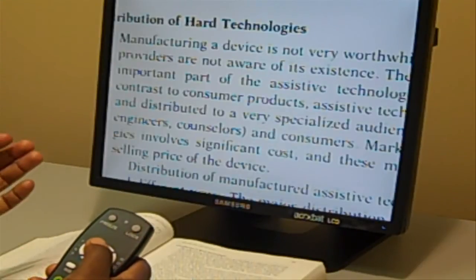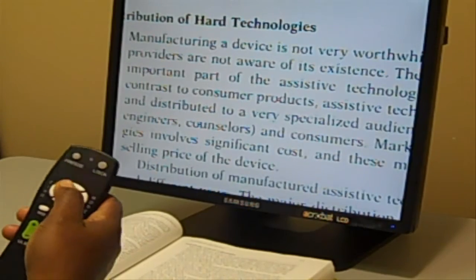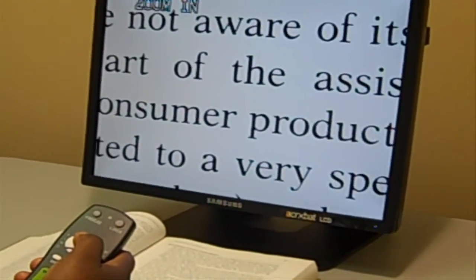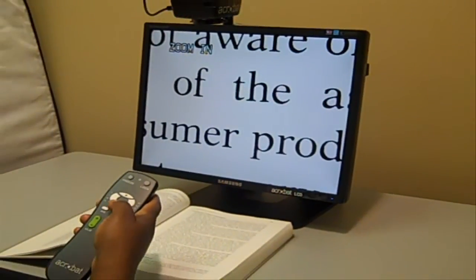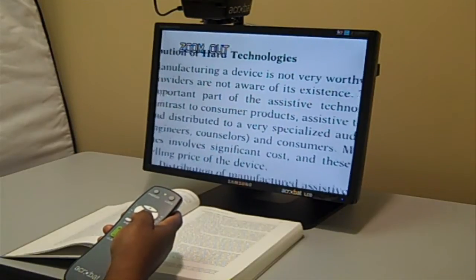If you need to magnify, you have zoom in and zoom out, which you use with the plus sign and the minus sign. The plus sign zooms in, making it larger for those that need more magnification. And if you need less magnification, use the minus sign and it decreases the magnification.